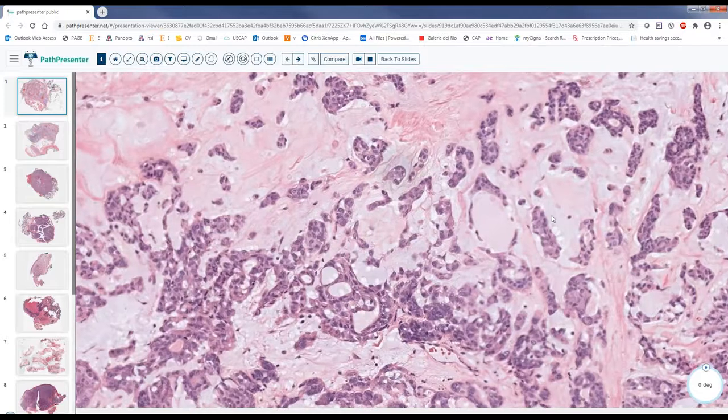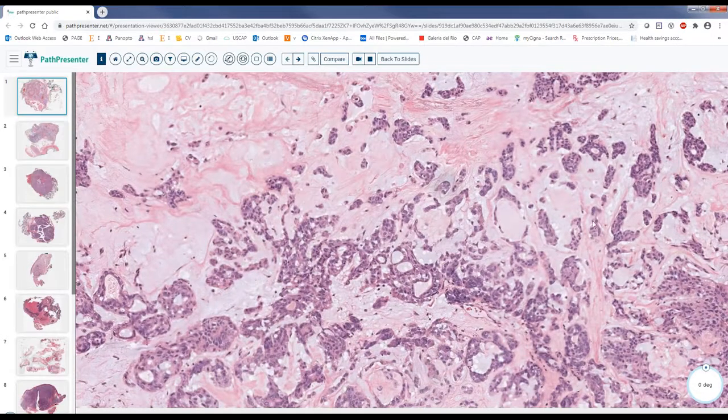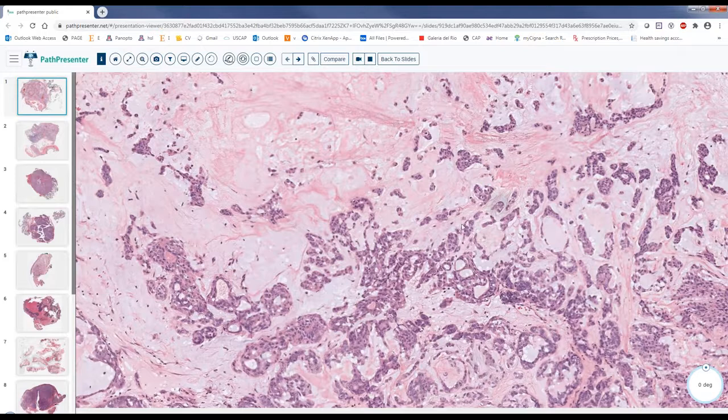What is the word that you like to use here in the background? What is the background secretion here? I hope you guys don't use mucin. If you use mucin in salivary gland, you are going toward a bad diagnosis, and sometimes surgeons will be confused. If you see a mucin, you're dealing with mucoepidermoid carcinoma. So we like to use the word that you said, myxoid or chondromyxoid.